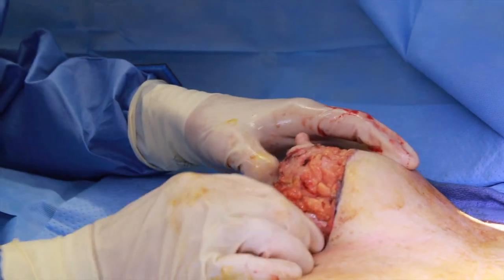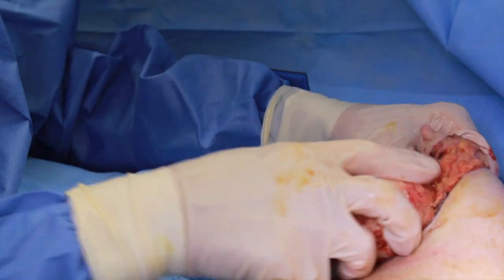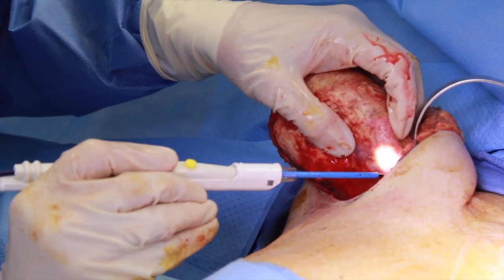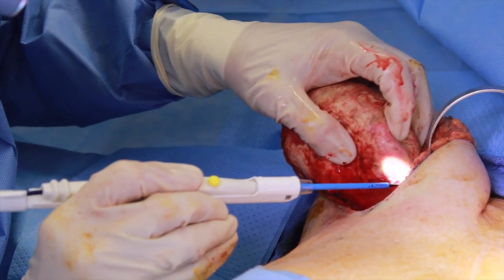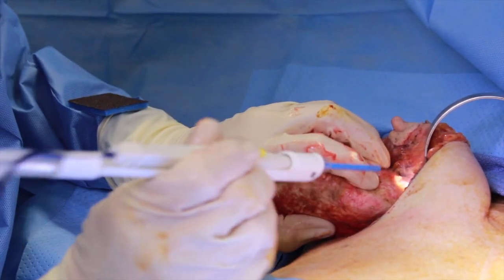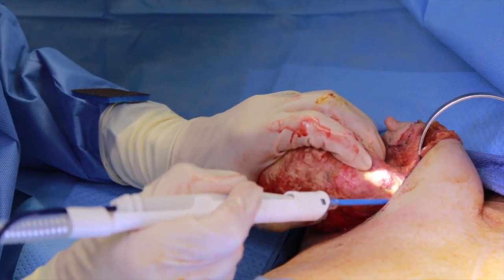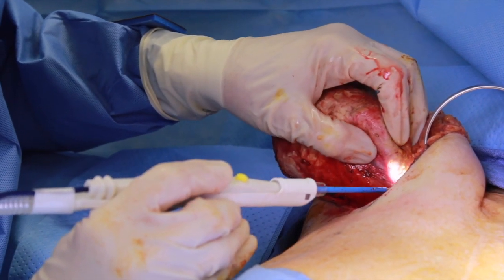So I'm going to try to deliver this and then we will view it for ourselves. You can see this implant — 30 years ago it was placed above the muscle, and that's also something we'd like to avoid if we can.